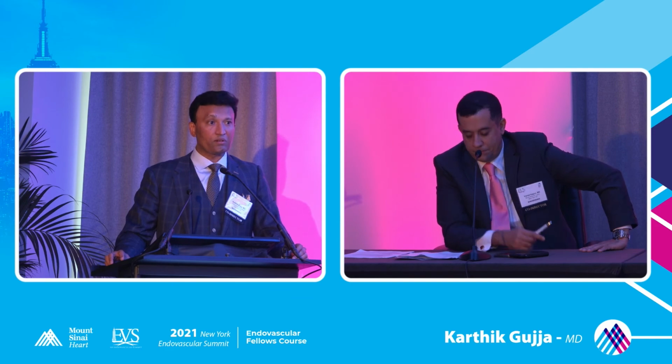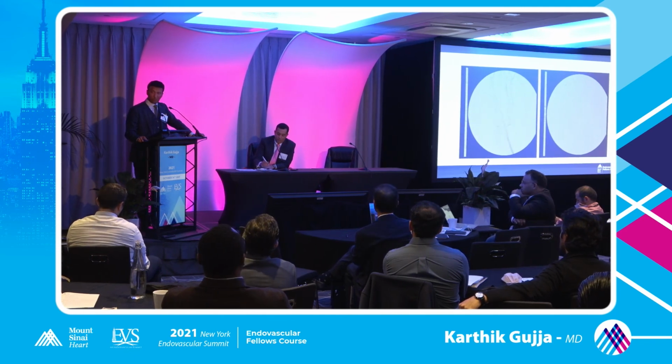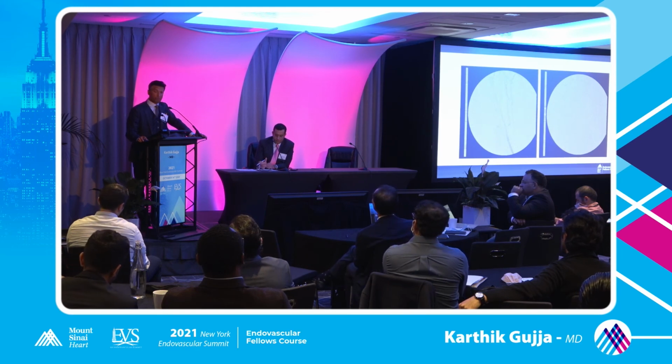And across we have the filter simulators. So Karthik, I think there's a filter workshop for the fellows. Correct. Yes. So you can play with both the Abbott as well as the Medtronic filter during the workshop. As I said again, I think it depends on you guys. You have to pick that choice. The biggest thing and the best thing about endovascular is there's so much armamentarium we have right now in our toolbox. So you can pick whatever you're comfortable with.